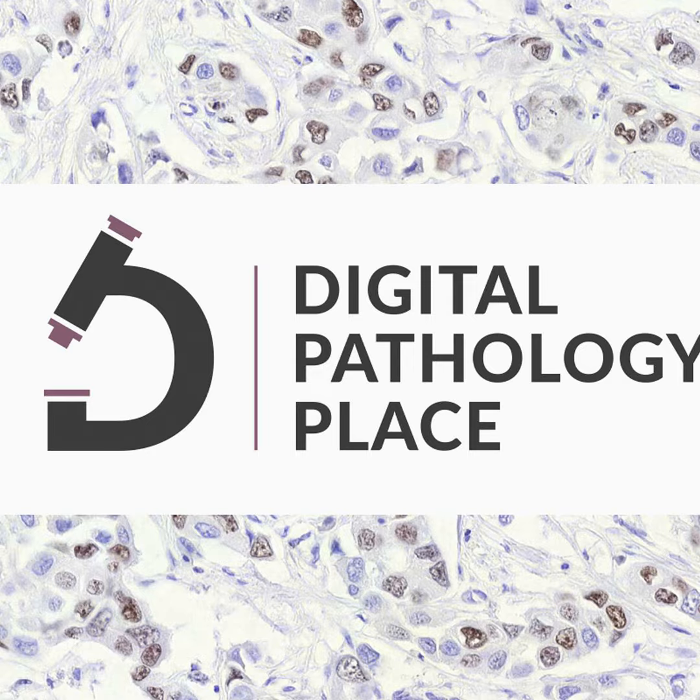What's the time called? The washout period. The washout period was long enough that I actually didn't remember, and in some instances I had no idea. Right, that's the goal. There are some pathologists who proclaim they have memories like elephants and never forget a case. But your results aren't driven by one reader, because there are 16. So if you do have one elephant in the room remembering everything, they're only 1/16 of the data.